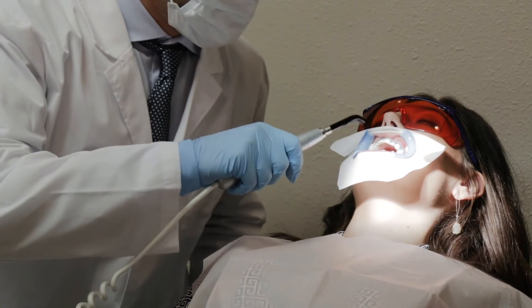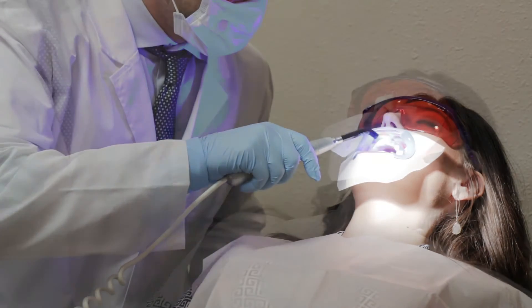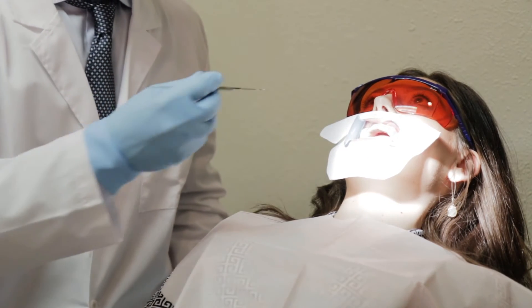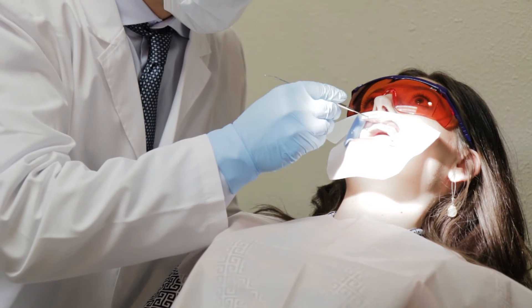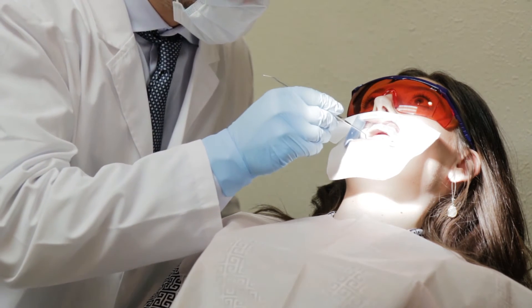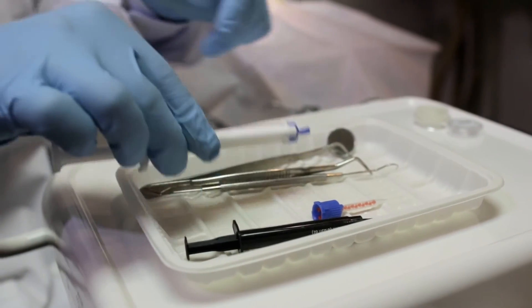Press the button on the LED curing light to begin curing. Move the device in a circular motion over the gingival area and light cure the gingival protection for 20 to 30 seconds, about 2 to 3 seconds per tooth. Use a dental probe tool to check that the gingival protection is fully cured. Do not over cure the gingival protection.